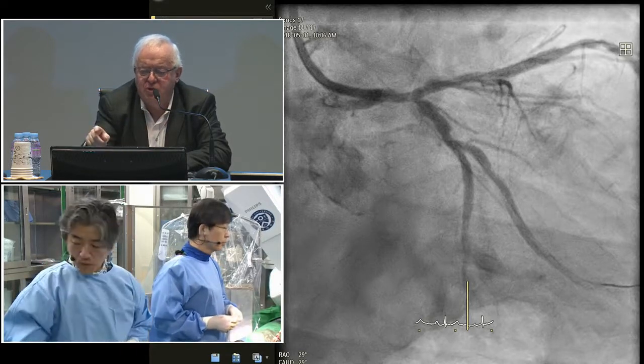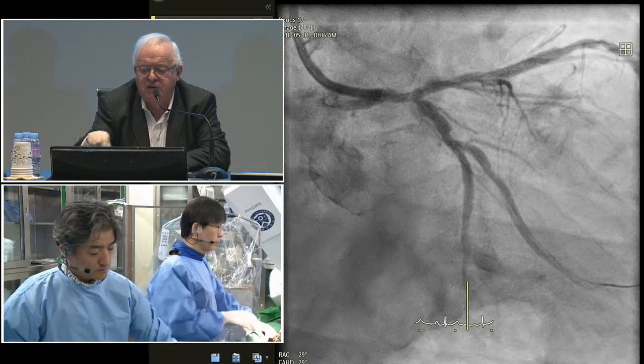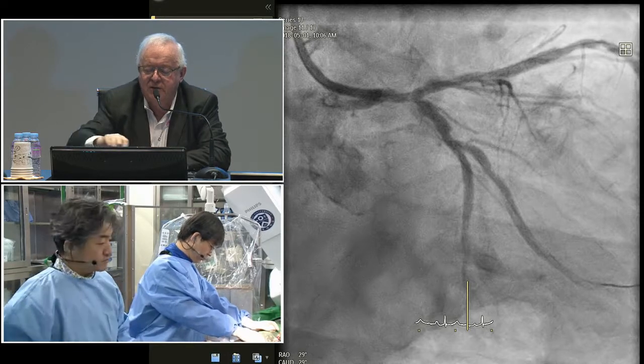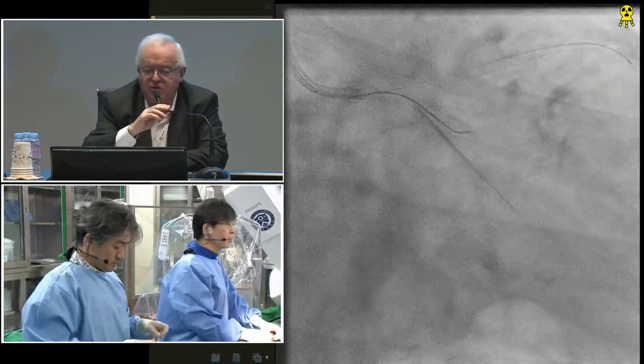Or another option is to begin with the left main and to stent at the end, after the kissing, either the whole proximal part of the circ or only the part affected by the lesion. So crossover stent to LAD for me.